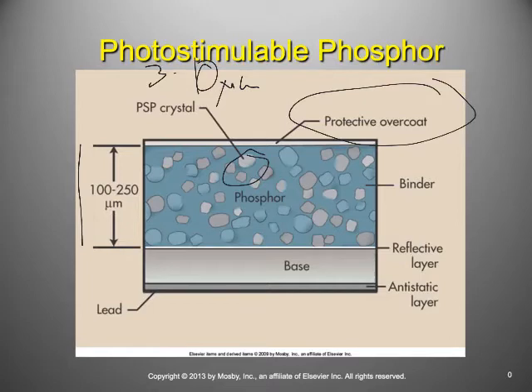A lot of times they're made out of barium fluorohalide with europium. So that's written BaFBr with europium. And that europium is actually the sensitivity center of the crystal.